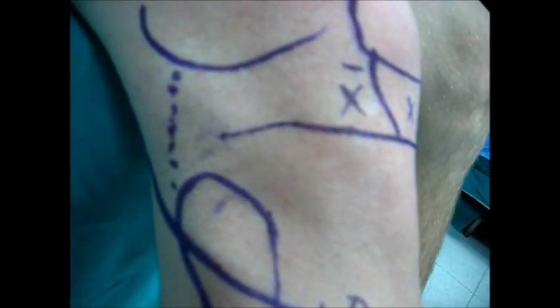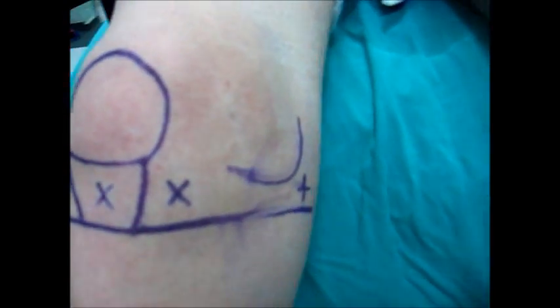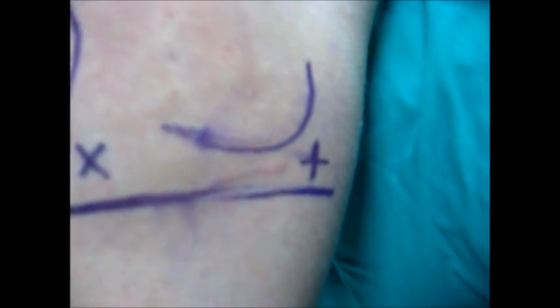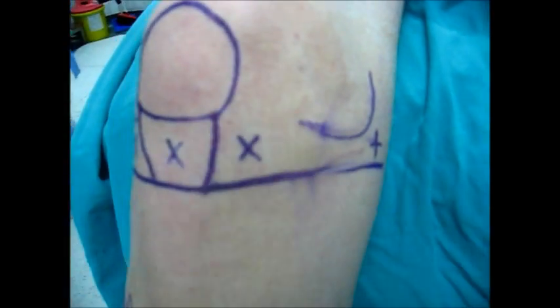This is the fibular head, and this is the posterior line from the fibular head which goes to the posterolateral portal. This is the posteromedial portal in the posterior medial corner of the medial condyle of the femur.